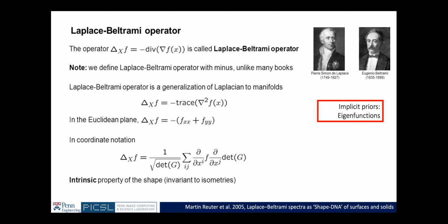So why I bring this is that suppose you have your 3D segmentation of a brain. You are very familiar with voxels. Now you can discretize it somewhat more and convert that into a mesh representation. And then you can apply this Laplace-Beltrami operator on that 3D mesh to get your Laplacian on a non-Euclidean surface, right?